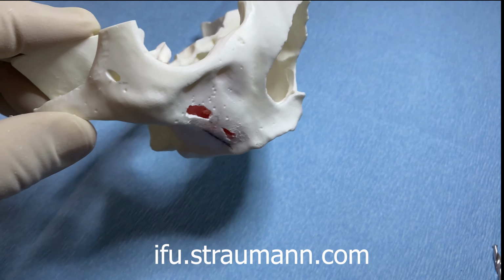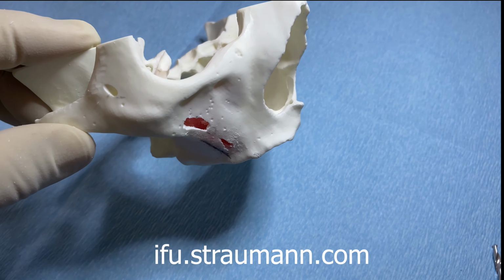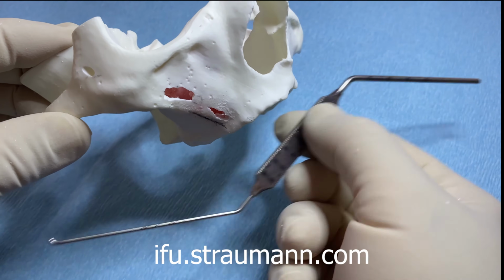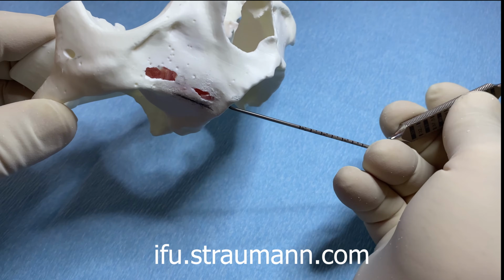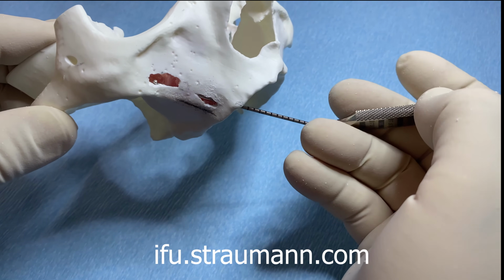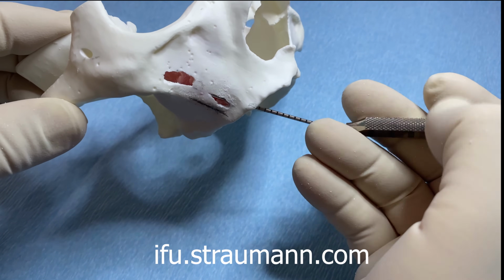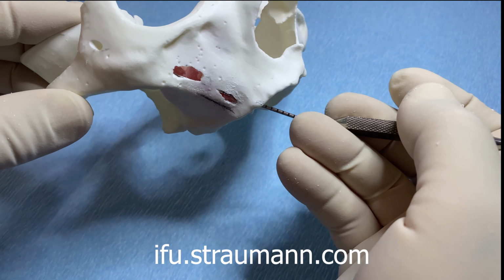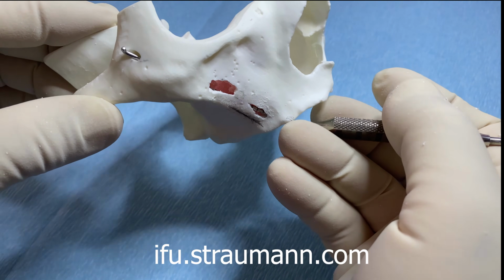It's absolutely essential, a must, that you see the tip of the osteotomy. So here's our depth gauge, and we place it inside the osteotomy. We can see again the depth gauge is absolutely butt up against the lateral maxillary wall. That's why that black dotted line is super important. We go through, and we go through the apex.